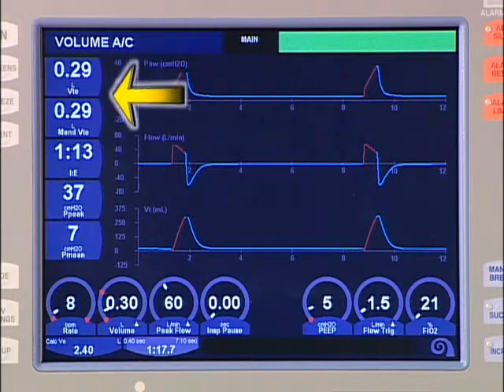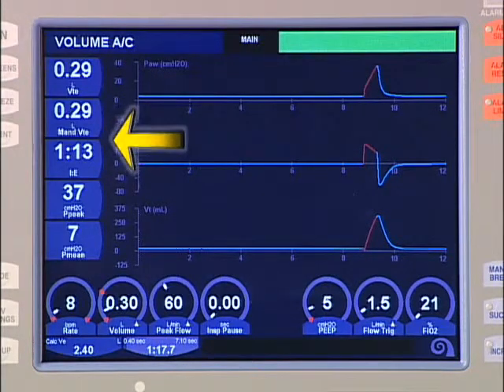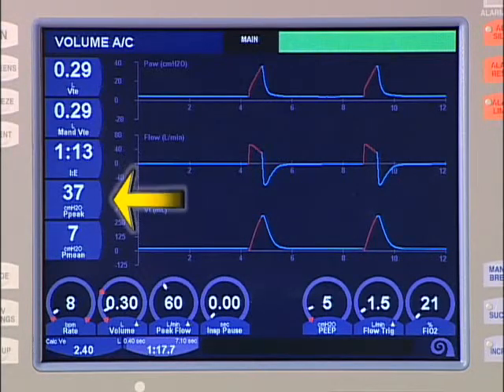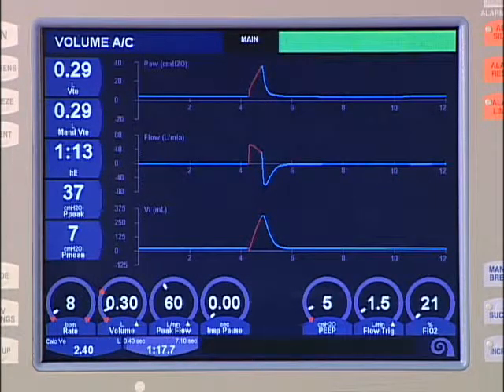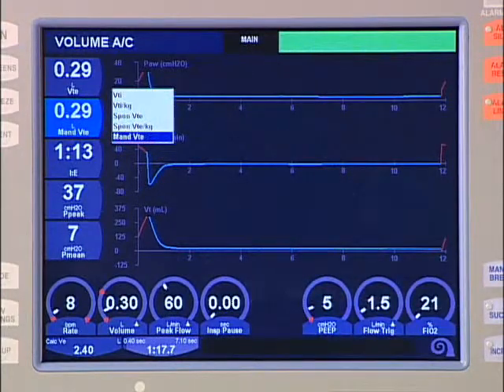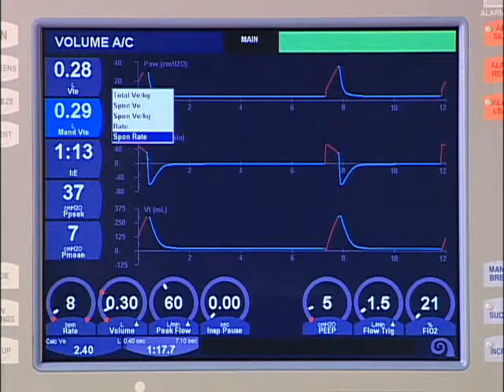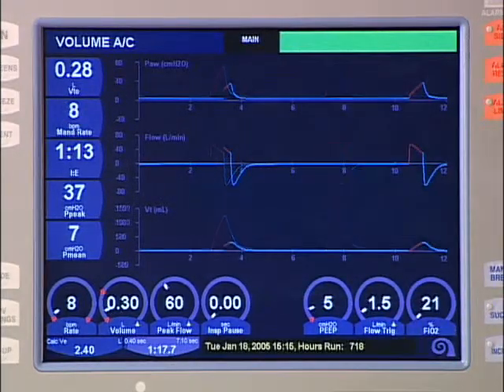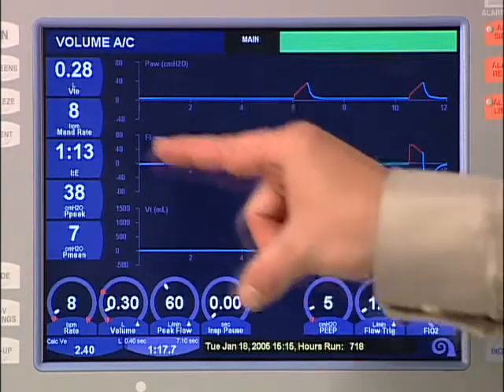The left side of the main screen displays user-configurable monitor data. Five values of the operator's choosing are displayed. To change the display, touch the screen over a displayed value and observe the resulting menu display. The data dial is then used to scroll through and highlight the desired item. Touching the screen over the display again or pressing the accept key accepts the new display configuration. Note that the monitored values on each AVEA screen can be configured differently.